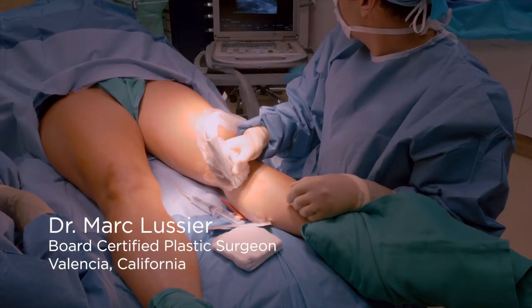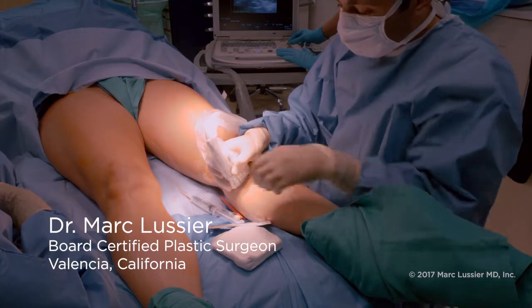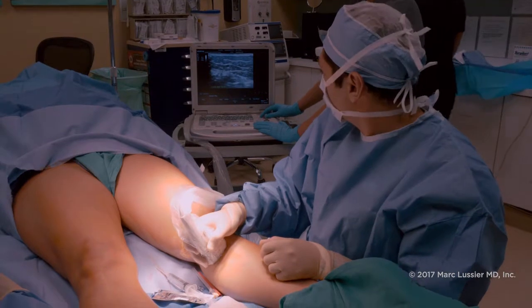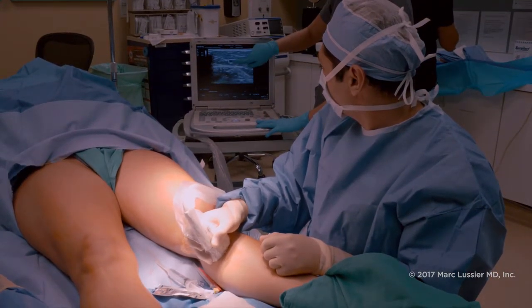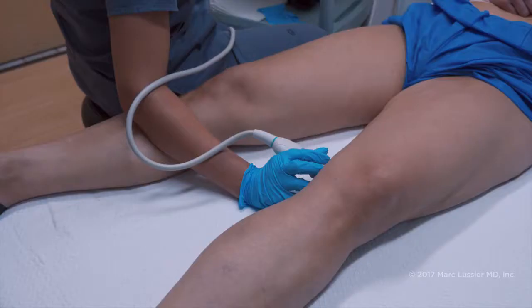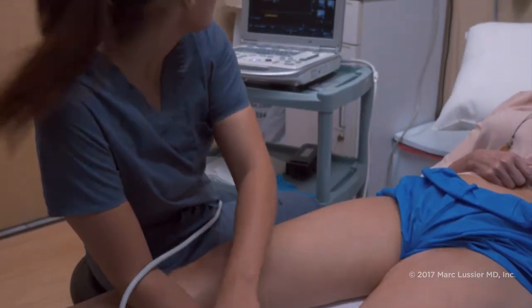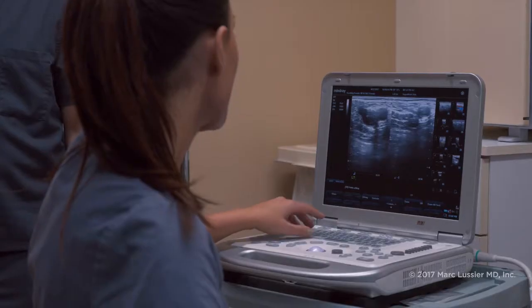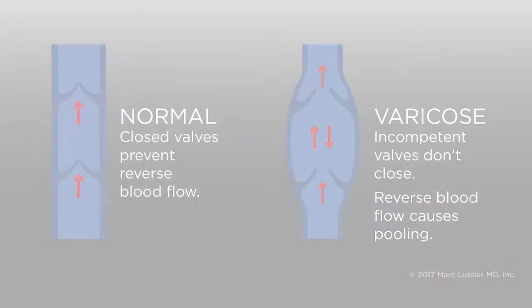Good afternoon everybody. We're about to do a radiofrequency ablation of the greater saphenous vein. Surin, our ultrasound specialist, is now locating the greater saphenous vein — if you look on the screen of his ultrasound device you can see a dark circle in the middle that he's squishing. Our patient today has already had ultrasound done preoperatively and the problems identified in her venous system are with the vein valves.